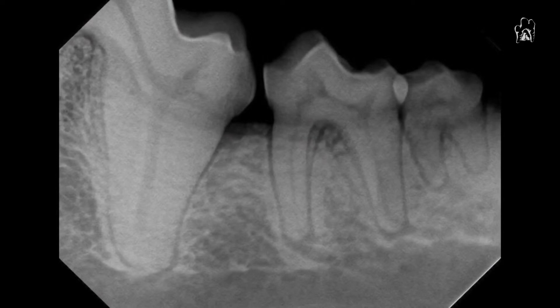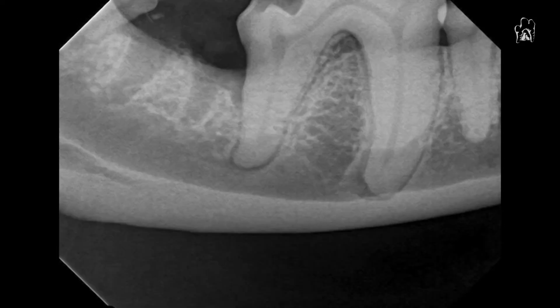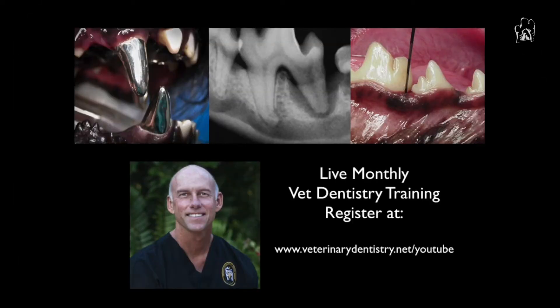So here's before again, and then here you can see after — you can actually see the defect a little better there on that radiograph. And then here's a pretty significant defect on another case on the right side where we've extracted that tooth and then put a bone graft in there, and then we have a post-operative view that shows six months down the road. This is probably similar to what you see three months to six months down the road and then from that point on.